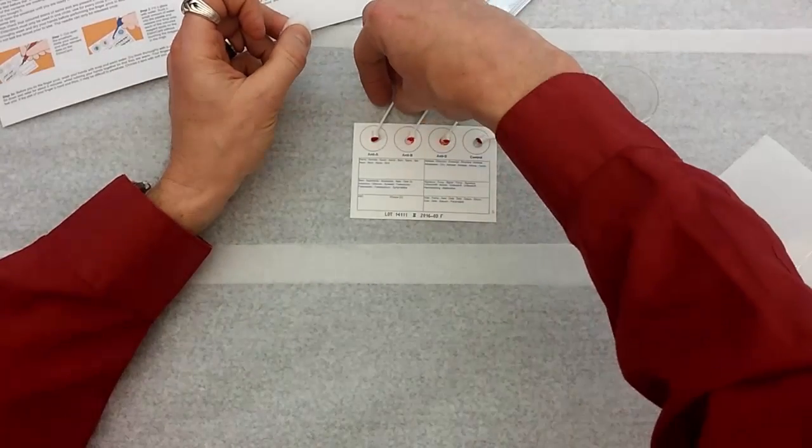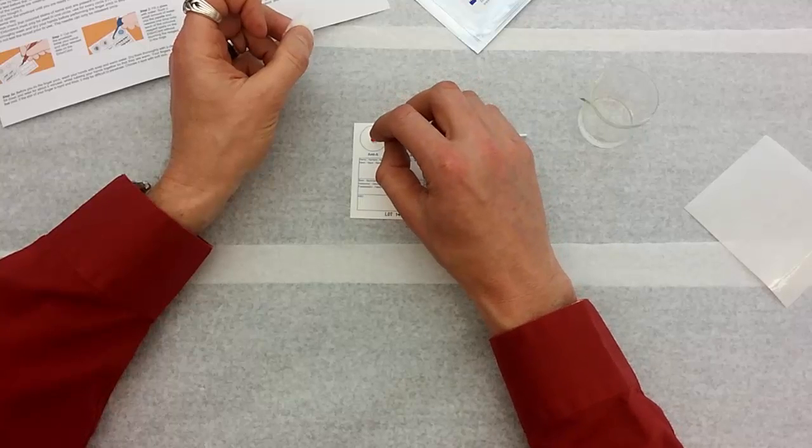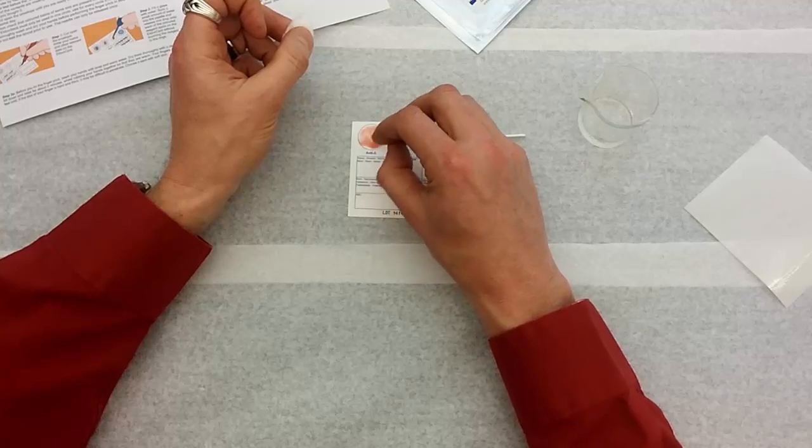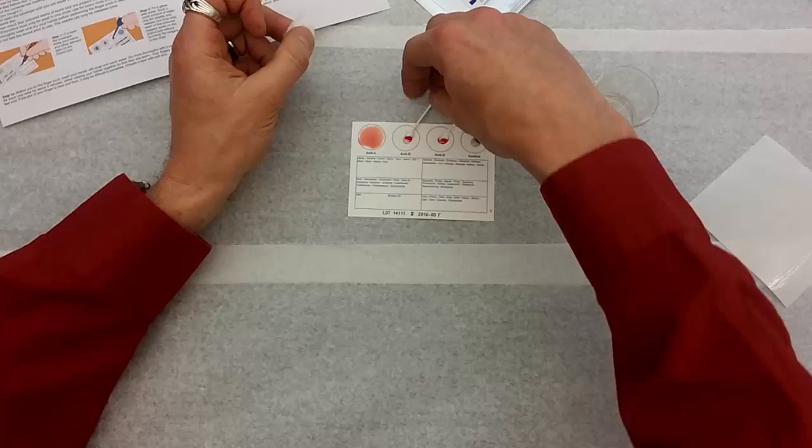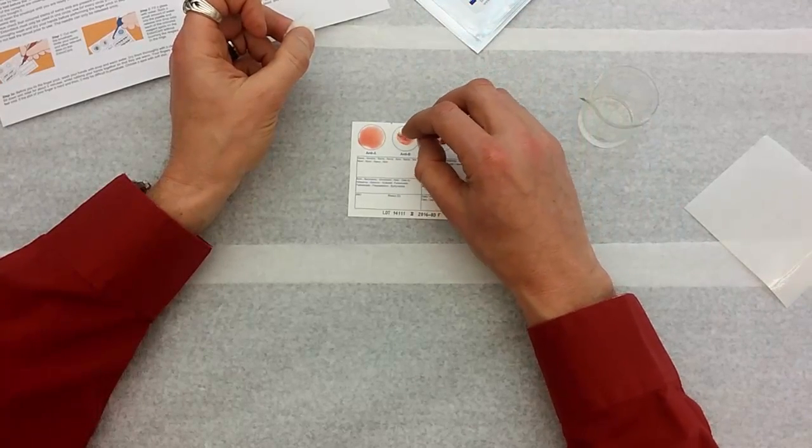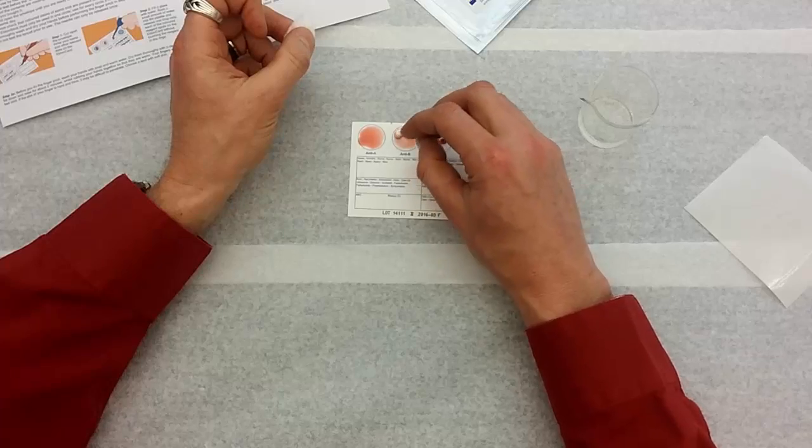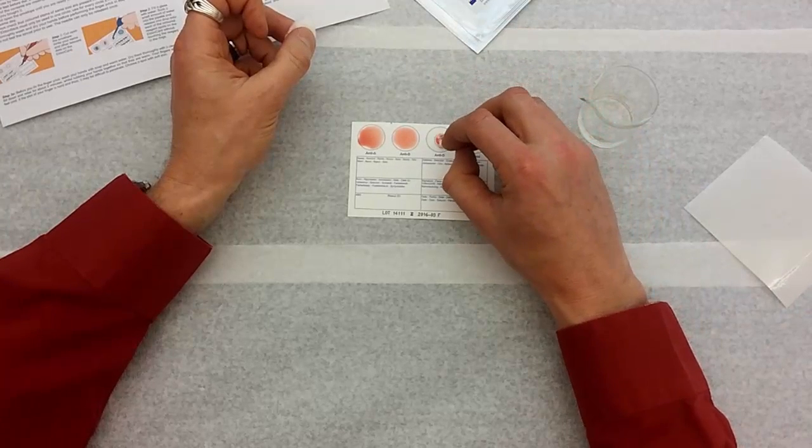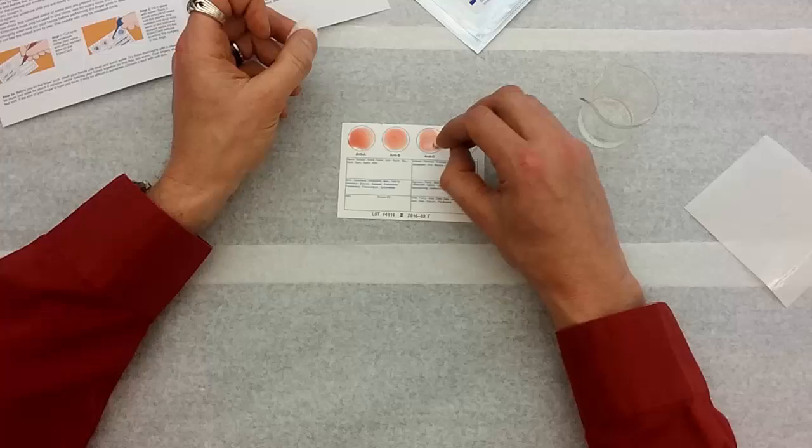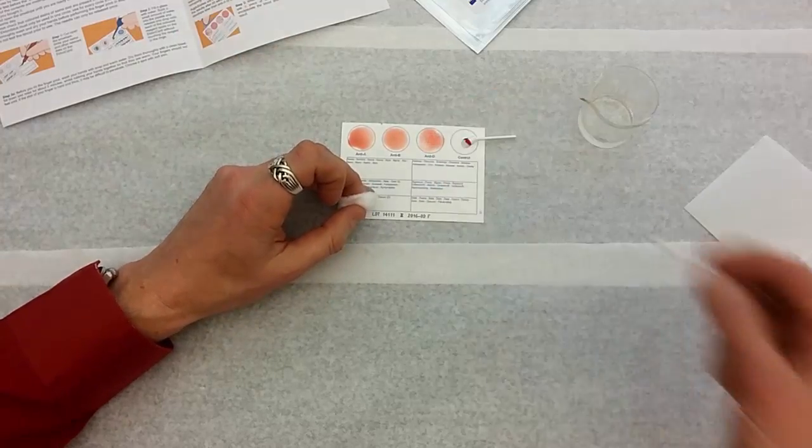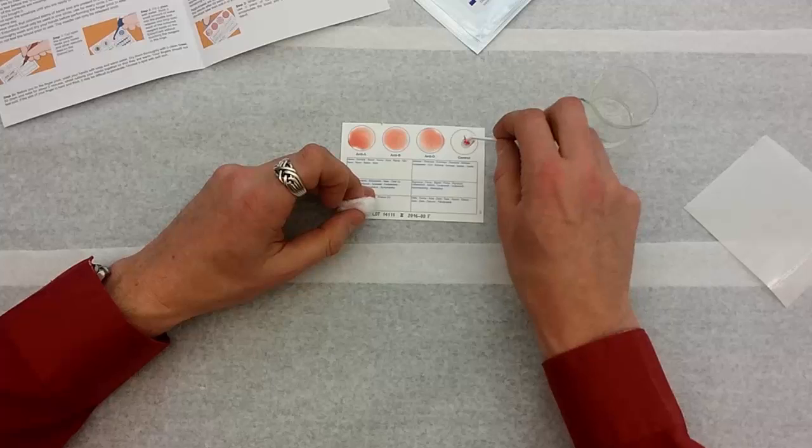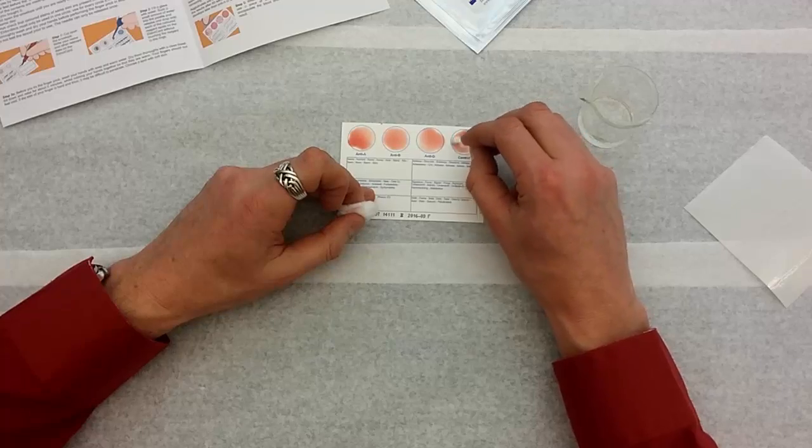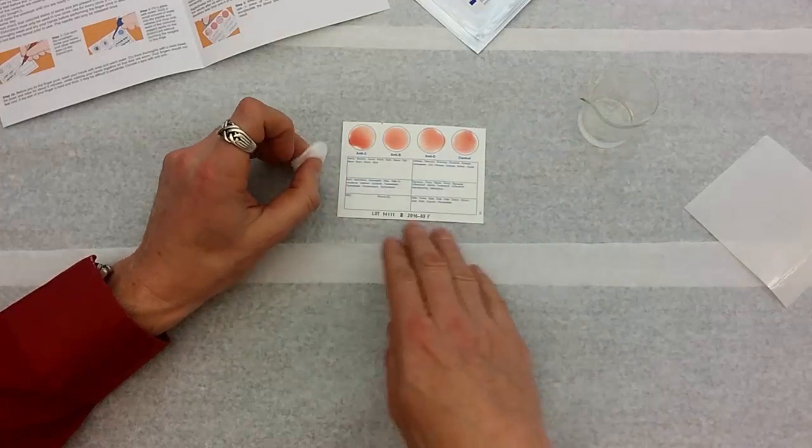And the next thing to do is to pick up each one of these spatulas in turn and stir up the sample and spread it out in that circle for 10 seconds. And then toss the spatula. Got to stabilize the card. And we're done with that mixing.